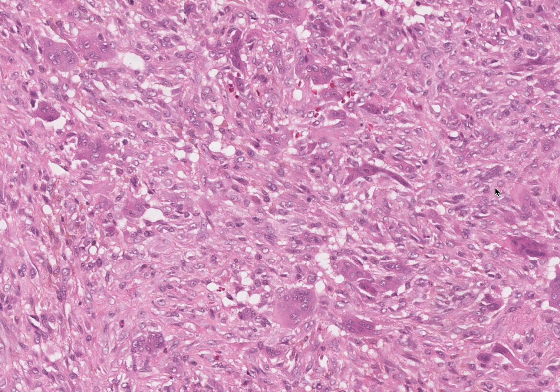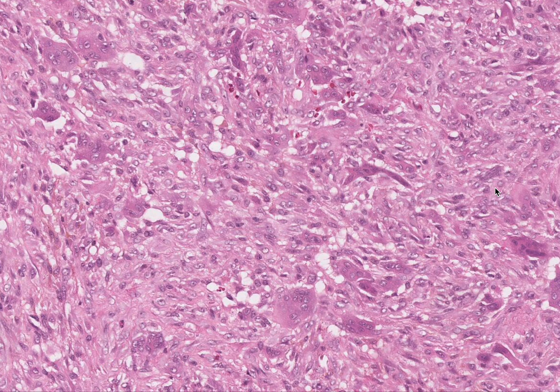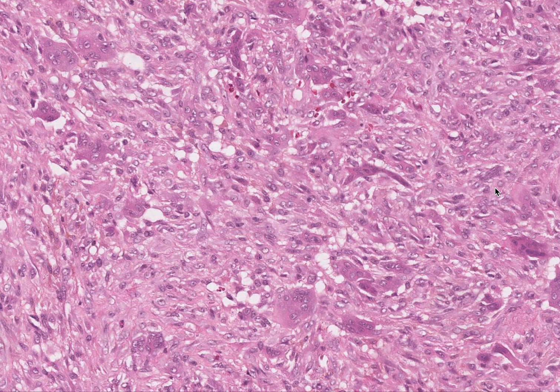So I have three things here in this microscopy. Let me give you a brief history again: a 40-year-old, knee joint biopsy, somewhere around the knee joint. I'm having lots of giant cells, areas of hemorrhage, and elongated spindle-shaped cells. The first question I want you to comment on: what are the tumors of bone or bone-related soft tissue lesions which are rich in giant cells?